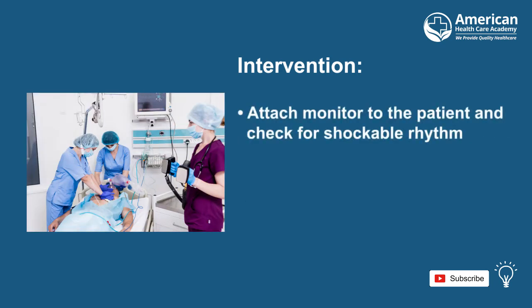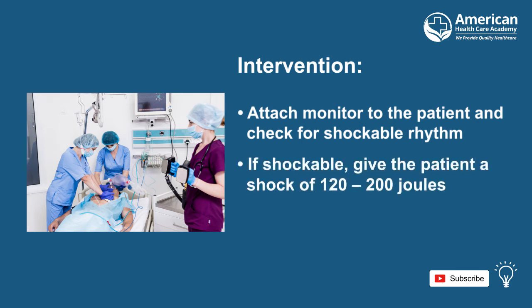Attach a monitor to the patient and check for a shockable rhythm. If shockable, give the patient a shock of 120 to 200 joules and start CPR again.